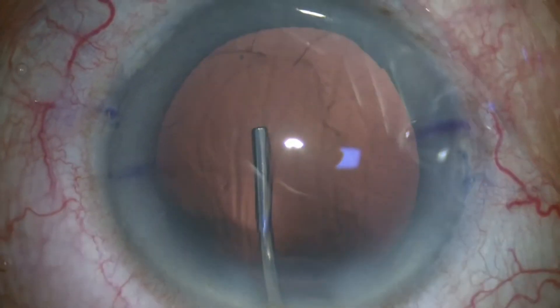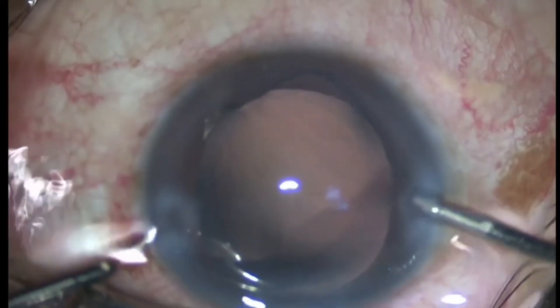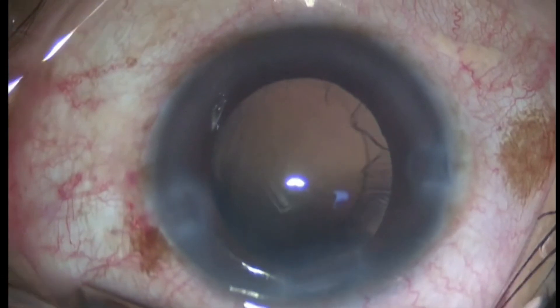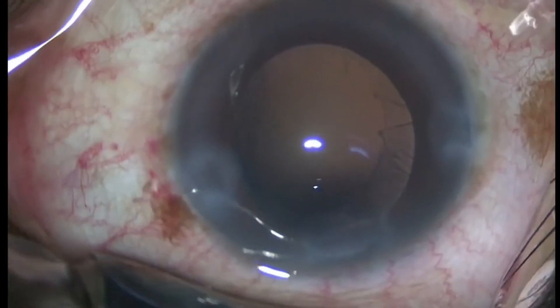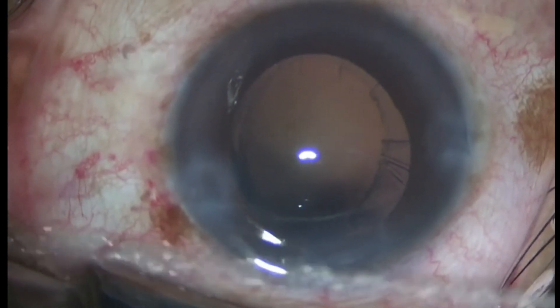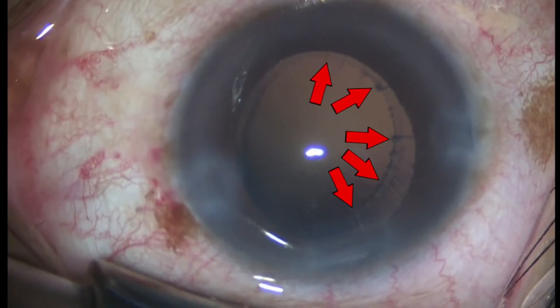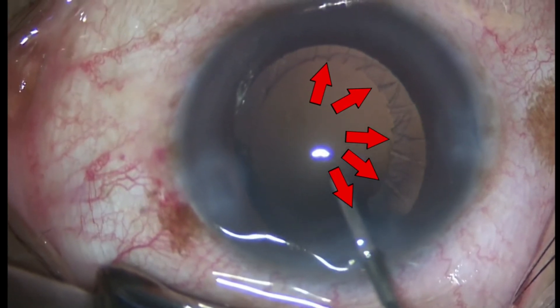These disappear as the capsular bag is inflated with an OVD. We postulate that on removal of the irrigating cannula, deflation of the capsular bag causes the posterior capsule to bulge forwards in areas where the posterior zonules are weak, while it is held back in place in areas of intact posterior zonules, giving rise to the radial folds or lines which we call the PC radial sign.